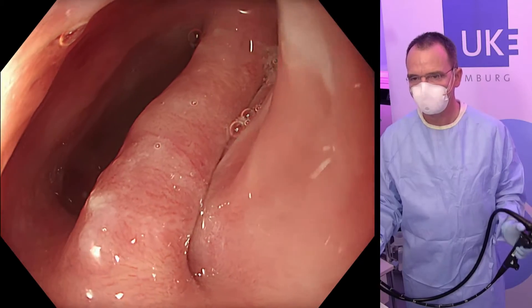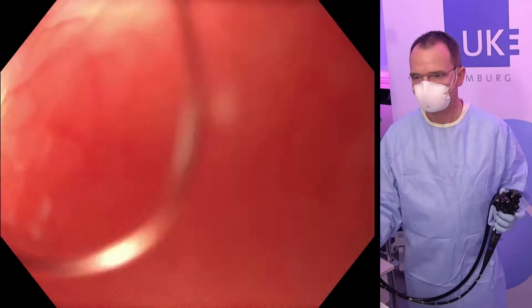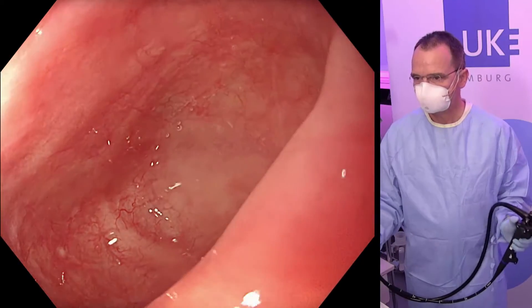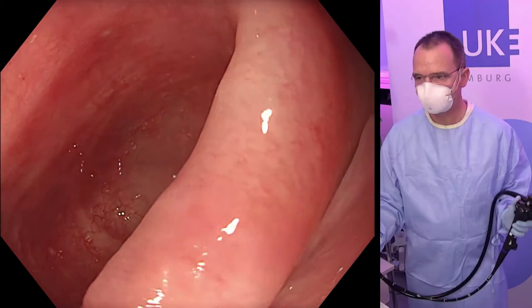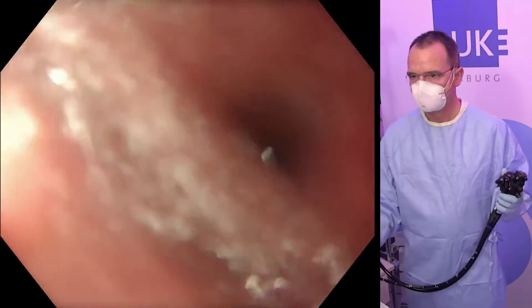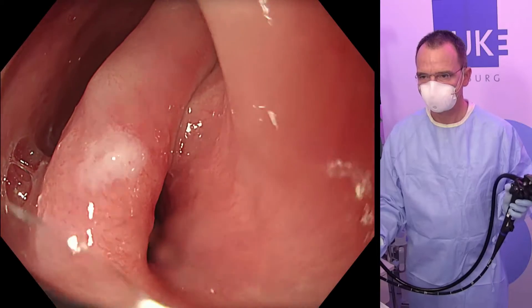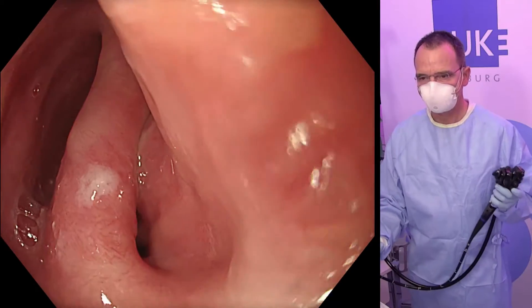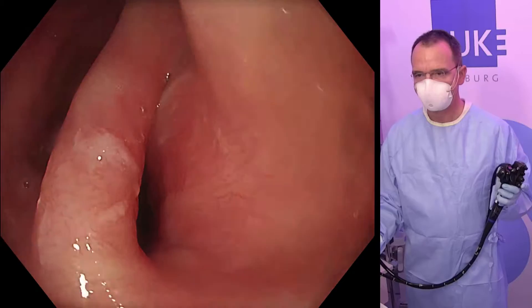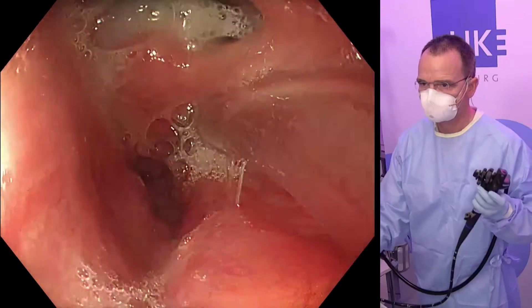This is a 72-year-old patient. On the left side is the diverticulum with an estimated size of about two centimeters, and on the right side is the entry into the esophagus — the esophageal lumen. The plan is to place a gastric tube into the esophagus to help with orientation during treatment and protect the contralateral mucosa.